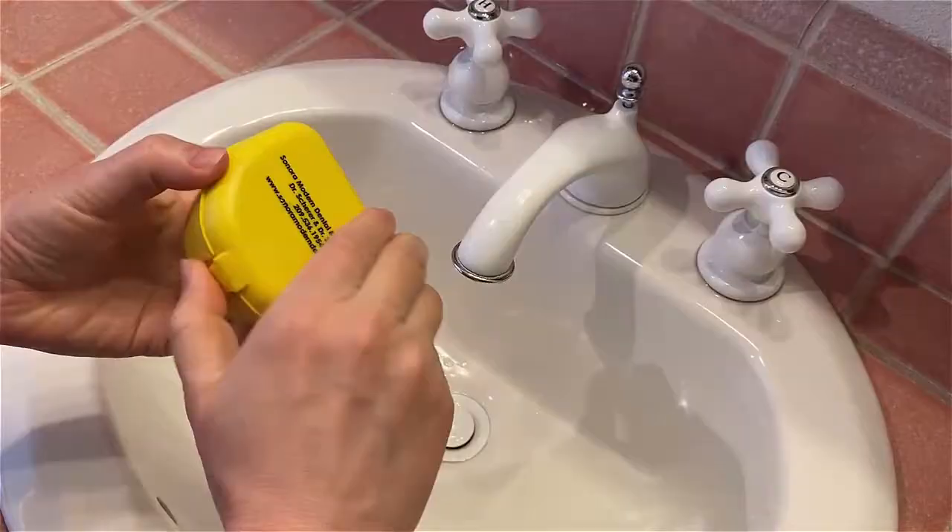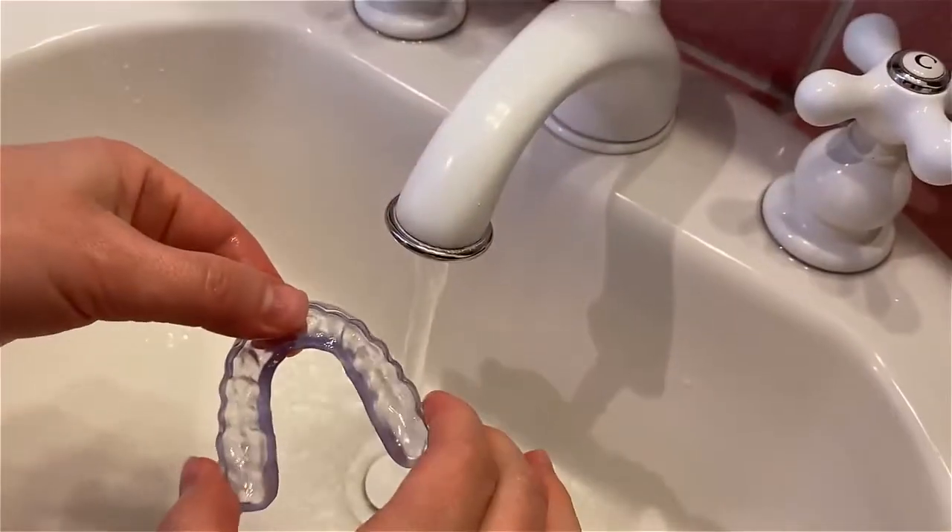After running it under just a bit of warm water, it's very easy to place and remove, and is comfortable to wear for the entire night. After a week of wear, I'm going to continue with my new guard, but I highly recommend giving the new KeySplint Soft material a try in your practice.